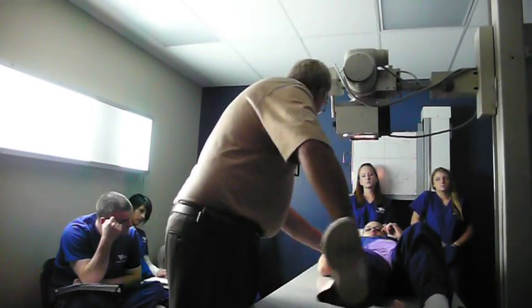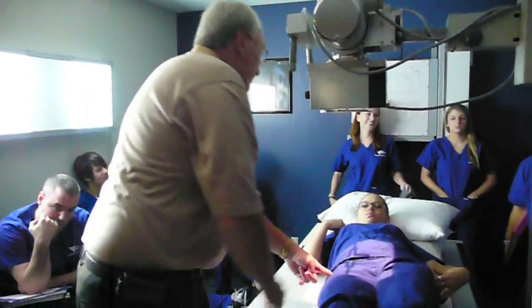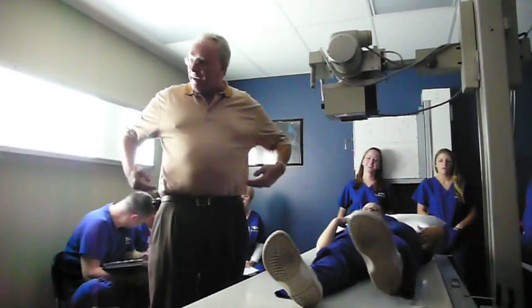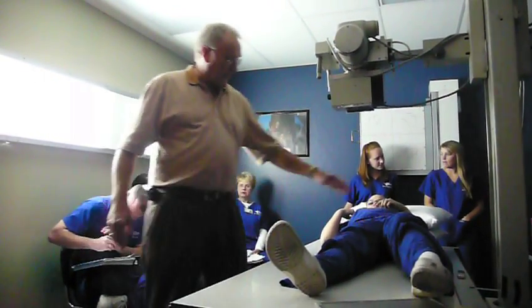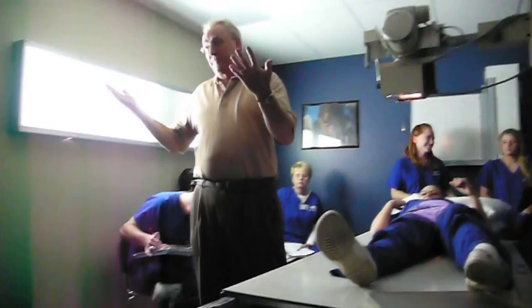Greater trochanter — when I move her, I can feel it. There's the greater trochanter right there. The greater trochanter's going to be right in the middle of my film. If they just have hip pain, you can ask the patient. You don't have to move very much — you can easily feel it. The crest, ASIS. Well, if you can't feel the crest, I've always gone two finger-widths below the belly button. I can draw my line across or just set my IR.